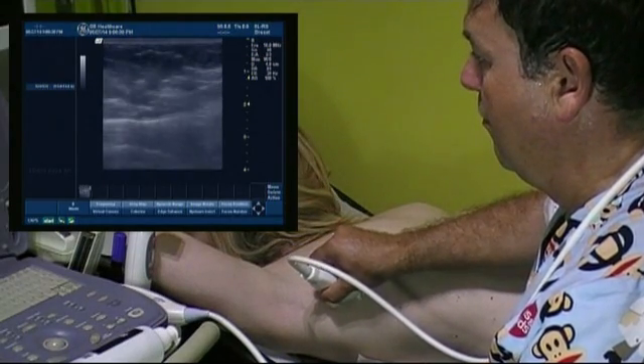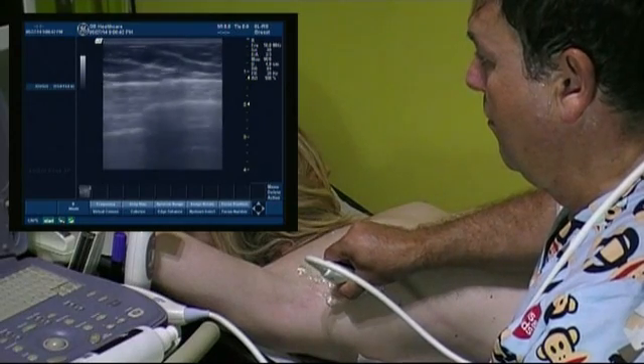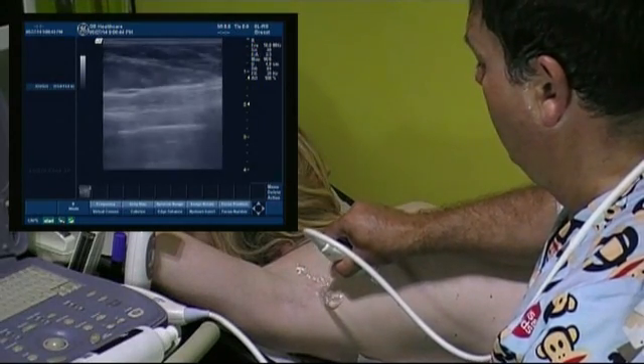For less experienced examiners it is recommended that we perform the scan twice in order not to miss any minor findings.